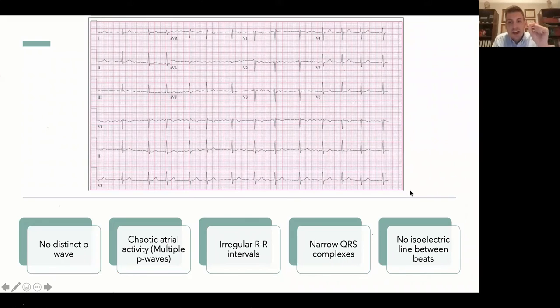It means that the atria fibrillate, they don't function correctly, they move a lot faster than the ventricles, they fire non-stop, and only a handful of those multiple impulses go from the atria to the ventricles, where we will have normal QRSs, because even though they occur at random times, so it is irregular, okay, the AV node tries to save the ventricles from the fibrillation that occurs in the atria.